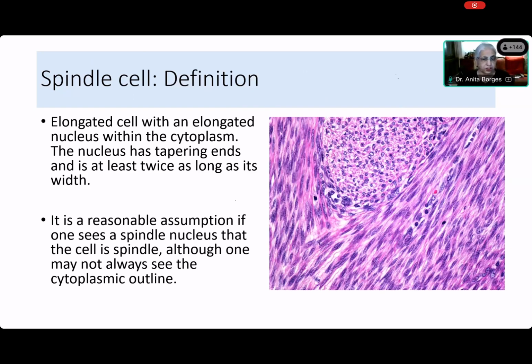What is oval to polygonal shape, Shashank? Ma'am, some are oval and some are polygonal. That's fine. But what are you seeing as oval? Then we'll come to the polygonal. I assume that you are talking about the nucleus. Yes, ma'am. Okay, good. So really, what you are talking about, Shashank, is this area, right? Yes, ma'am. I'm talking about this area.